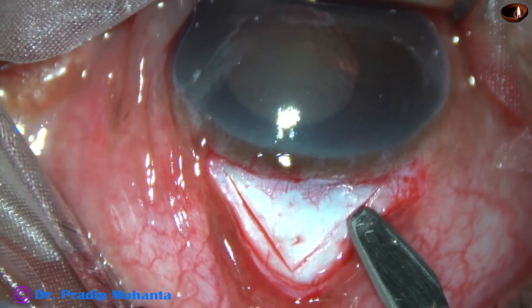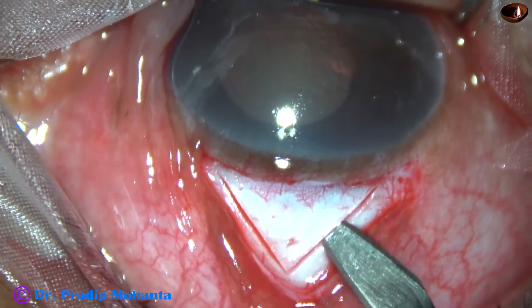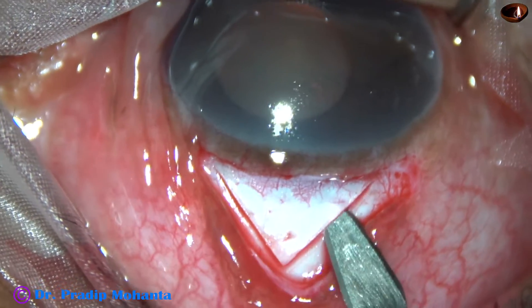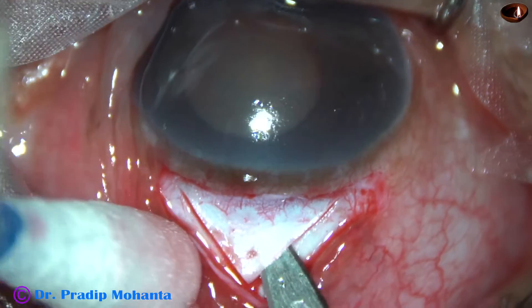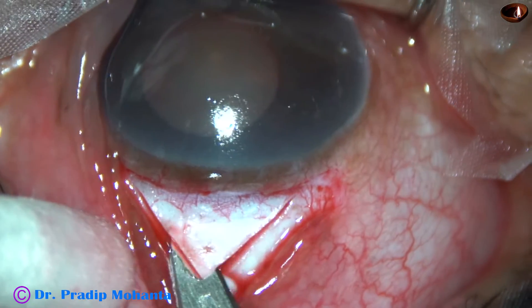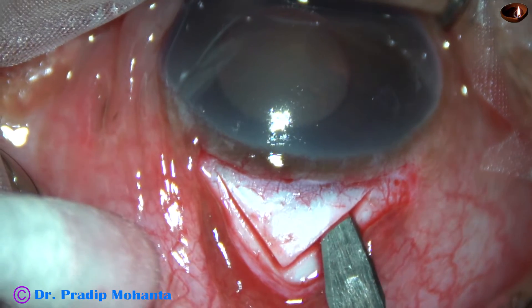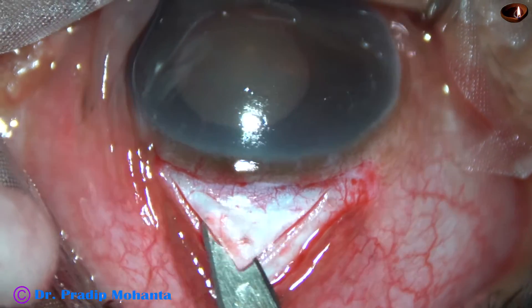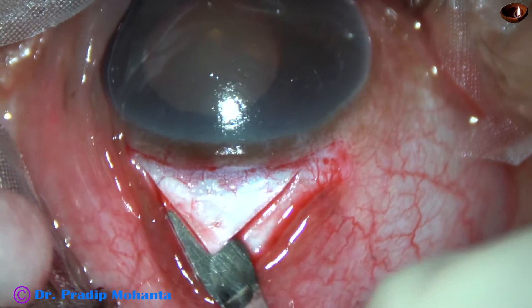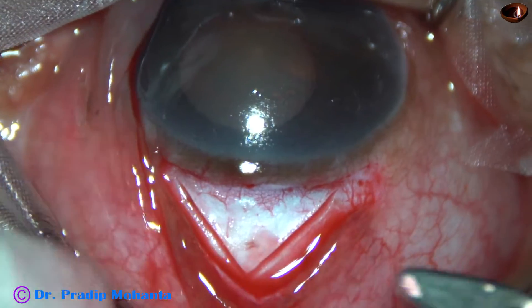Better is 50% depth. Now I have taken this crescent blade and at a particular plane I am going towards the limbus. If the bed is smooth, the filtration is good. If the bed is ragged, the filtration may be less. So I am trying to get a smooth surface underneath this scleral flap.